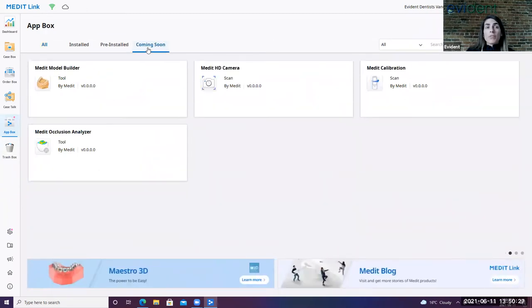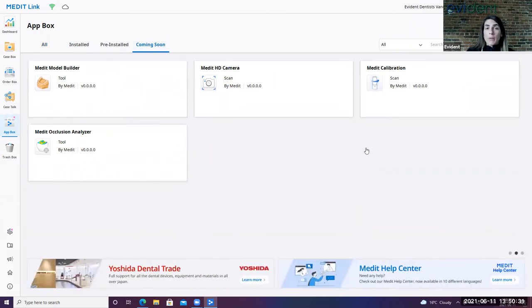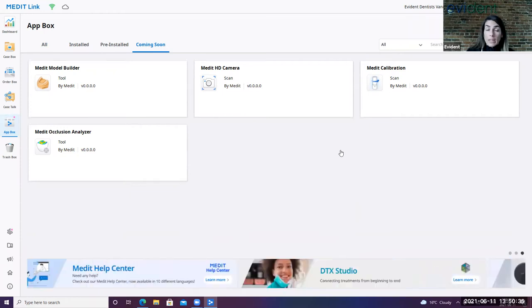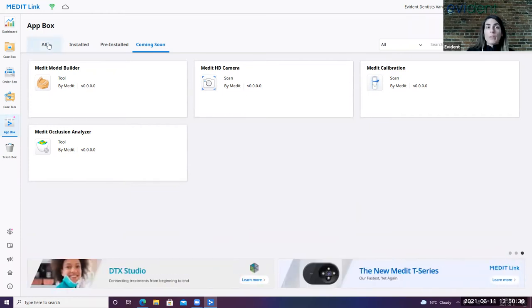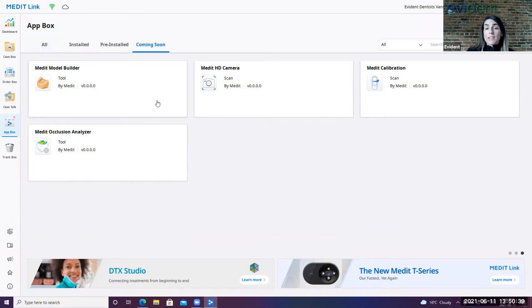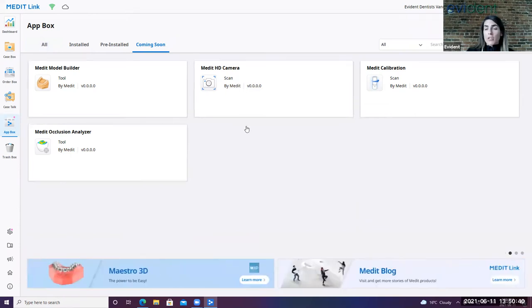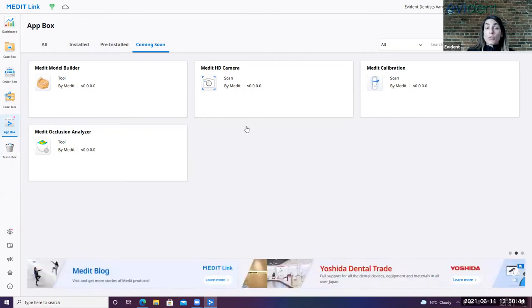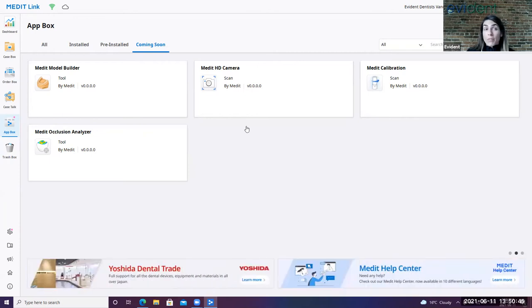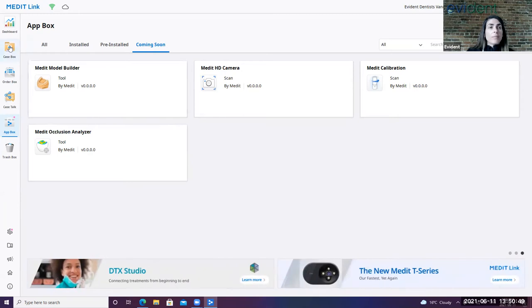In the coming soon section, Medit has listed four different updates that will be coming. Once these are available, completed and available for an update, they will be listed under the all. So it's great to see that they're making these changes so quickly after the release of the new update to the software itself when the 700 came out. So it's great to see that it's constantly progressing.